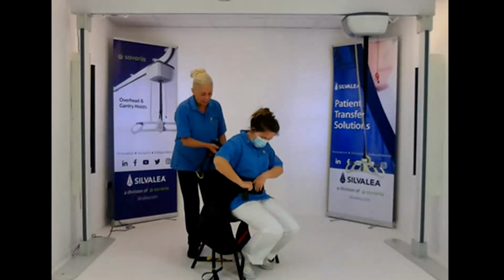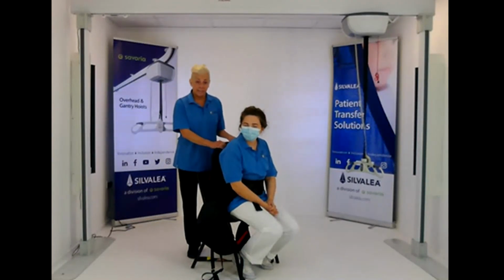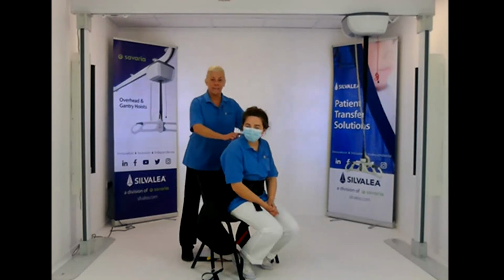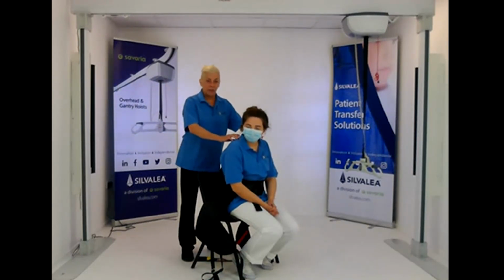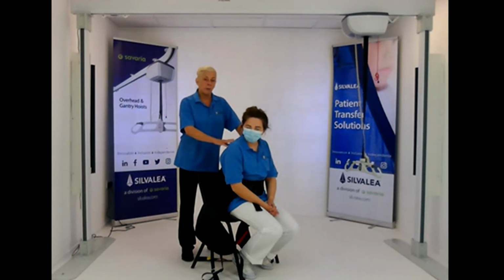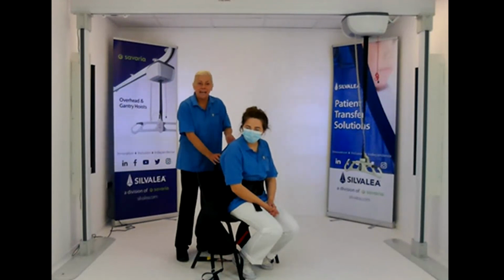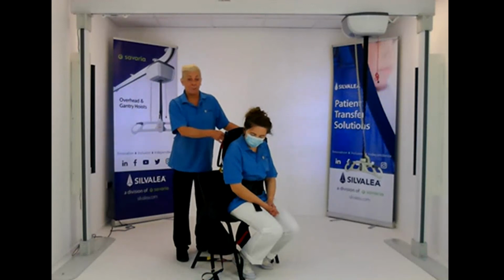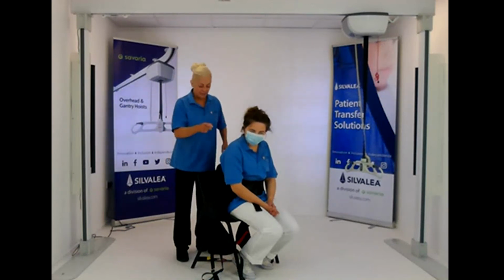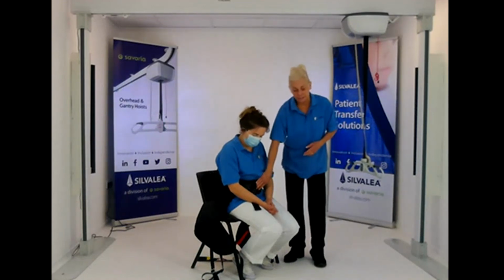Don't try and line up the top. There is a nice neck roll built in that you often find people want to line up first, get it in the neck, even though on the bed, we've got to get the neck roll in position. That will sort itself out when the hoist takes up the slack and the body naturally fits into the sling and the fabric stretches around. So the key thing is to fit it low and at the waist. So that is the first thing for positioning.